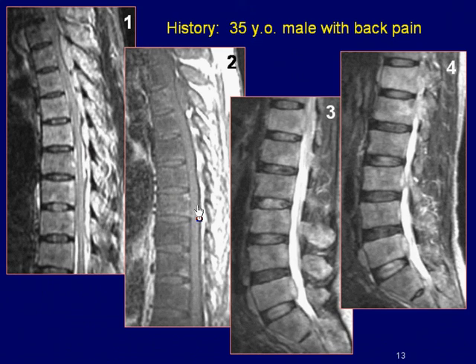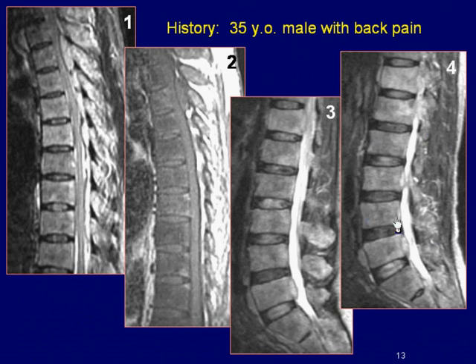Sagittal T1-weighted image shows diffuse low marrow signal of multiple vertebral bodies, indicating replacement of the normal fatty marrow. Sagittal T2-weighted images of the lumbar spine also demonstrate diffuse heterogeneous high-signal in multiple vertebral bodies.